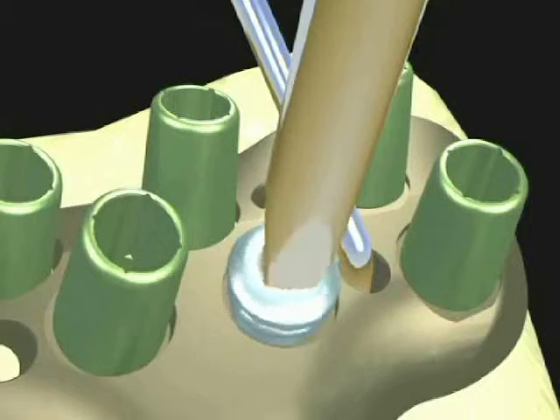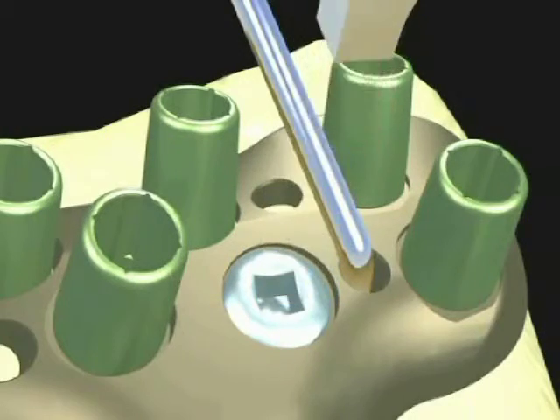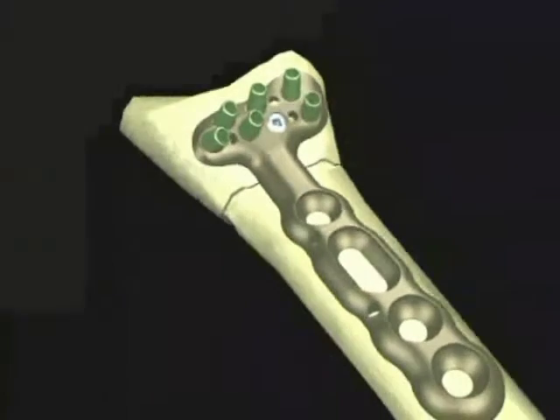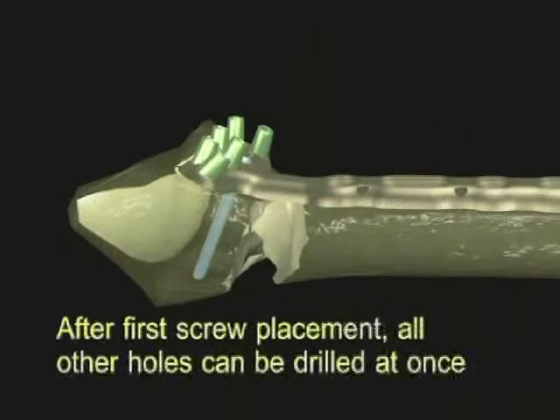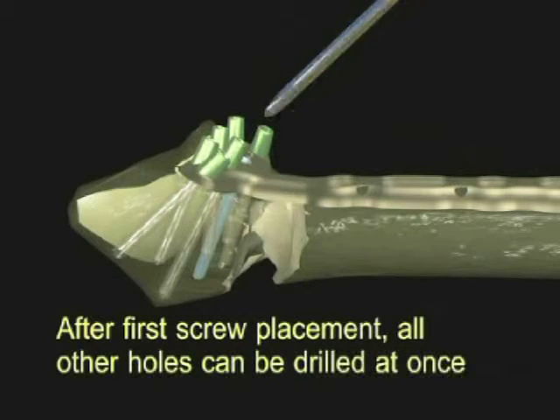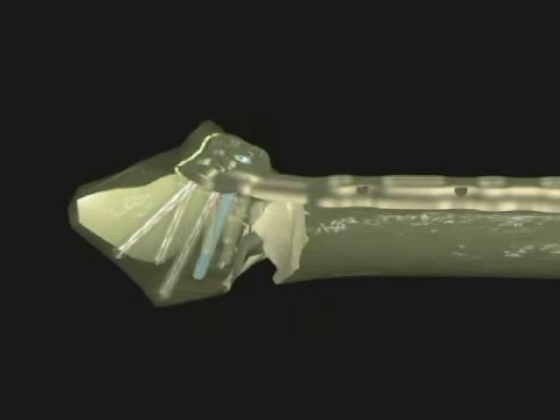Measure the correct depth for each of the pegs before or after removal of the fast guides using the proper scale on the fast bone depth gauge. Insert each of the pegs using the same fast peg driver until fully seated into the plate. After the first screw has been placed, all other holes can be drilled, measured, and inserted at once. Please be sure to remove all fast guides prior to closing the wound.